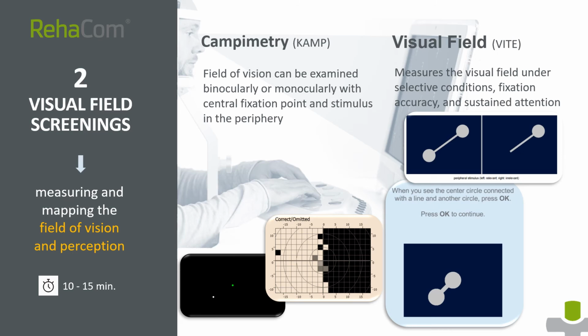There's a substantial amount of evidence that patients can be supported to compensate and adapt to visual field loss using a range of strategies and methods, such as systematic adaptive exploration exercises, saccadic eye movement exercises, visual scanning training including optokinetic stimulation in case of neglect, and re-establishing assigned perceptual functions by intense light stimuli. Depending on the test results, the corresponding training modules, saccadic training, exploration 2 or restoration training, are recommended to exercise these techniques.